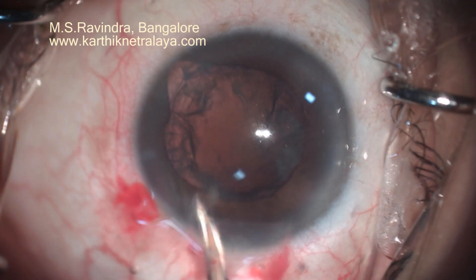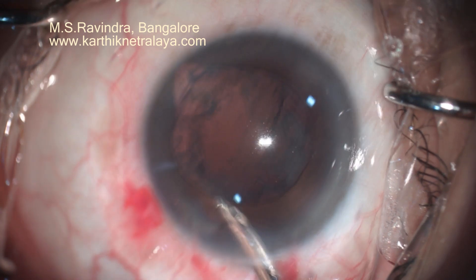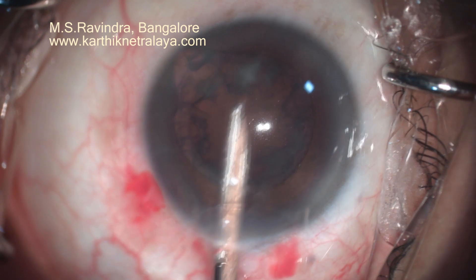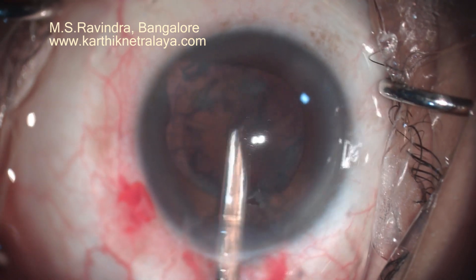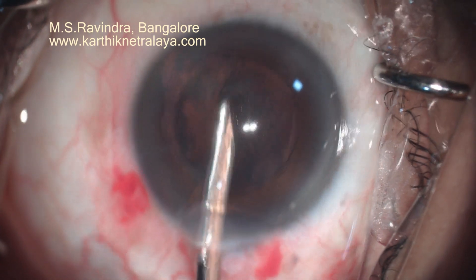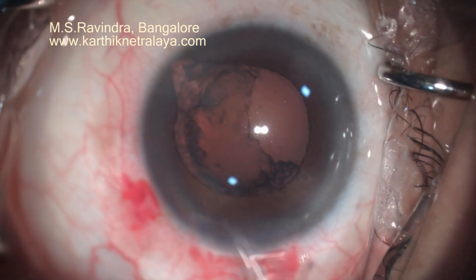It is very important to understand that this technique is outside the capsular bag, so there is no pressure or pull applied to the capsular bag or zonules throughout the procedure. The entire nuclear management is in the anterior chamber.